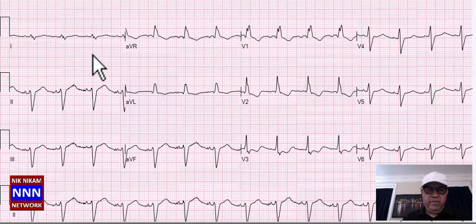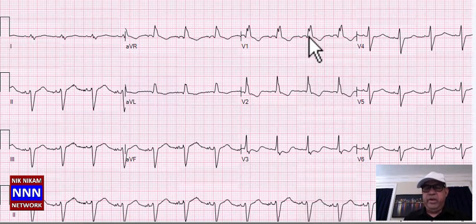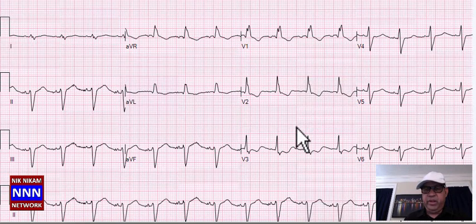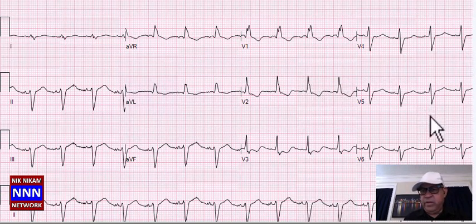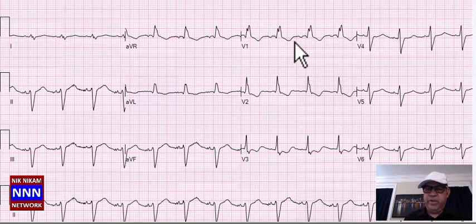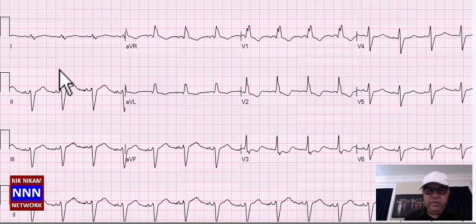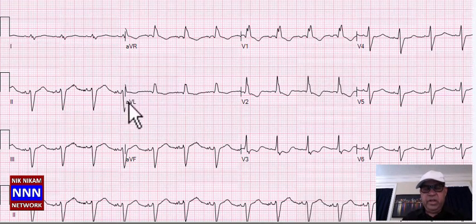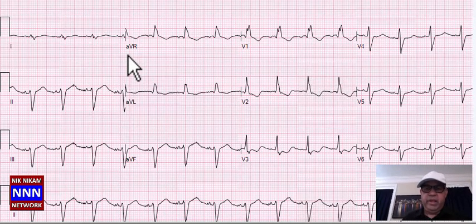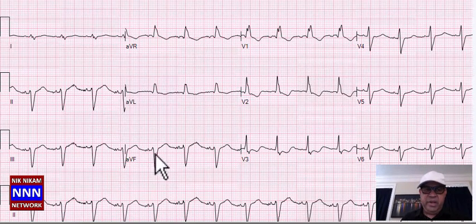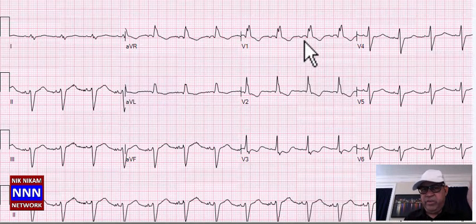Here we have what looks like a sinus rhythm with right bundle branch block. When you see a wide QRS — like a rabbit ear — in the anterior leads V1, V2, V3, and then a slurred S-wave in the lateral leads, this is diagnostic of right bundle branch block. Sinus rhythm with RBBB. The negative deflection in lead 2 is more than the positive, so we also have left anterior hemiblock and left axis deviation with non-specific ST-T changes — this is bifascicular block.